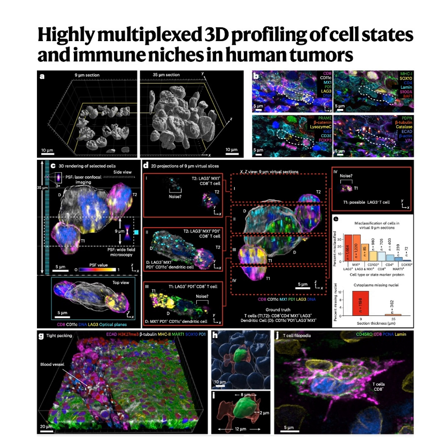We're talking about visualizing detailed organelle structures, things usually studied only in fresh or cultured cells. For instance, they could clearly see the highly characteristic multi-lobed nucleus shape that defines neutrophils, a type of immune cell. They could also identify distinct peroxisomes, small organelles involved in metabolism, by staining for a protein called catalase, and they could map the precise subcellular localization of key functional proteins.